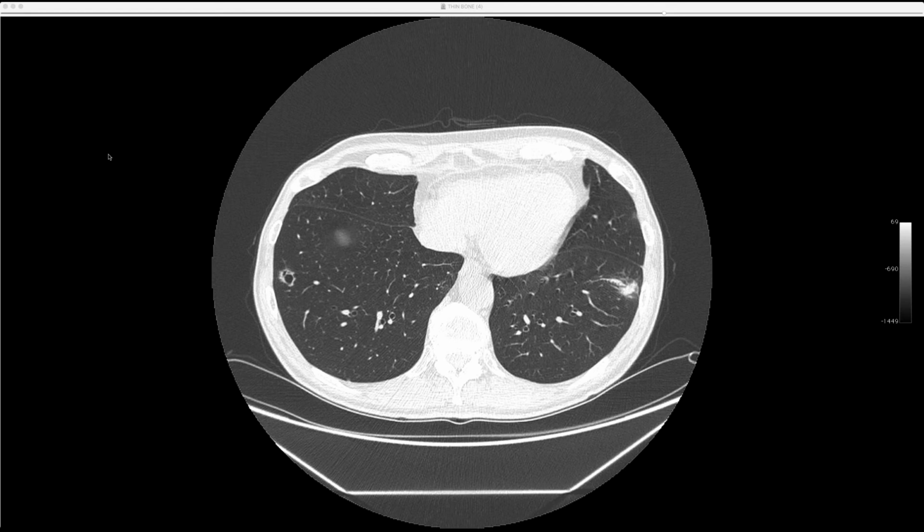So actually, these urothelial tumors are famous for cavitation with therapy. And I don't know where the therapy stops the growth and stops producing more and more material, and allows the old material to cavitate. I mean, to be liquefied and coughed out or something like that, resulting in the cavity.